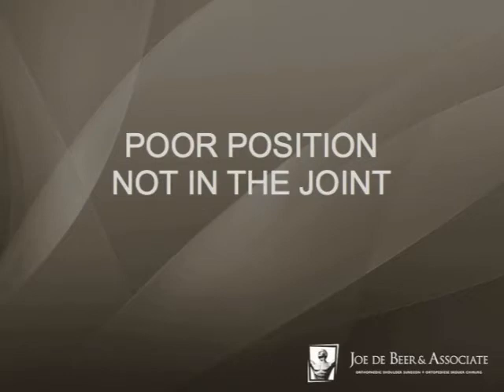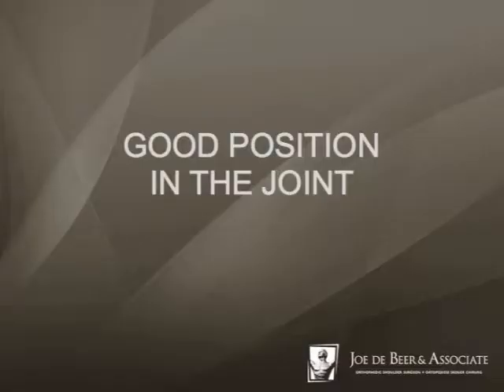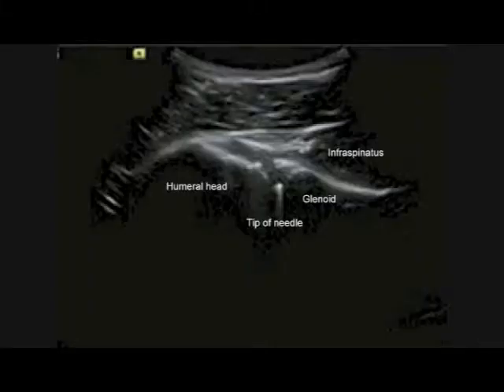To do glenohumeral joint injections with ultrasound control is very accurate. And the first one here is shown with the needle not in the joint because the fluid is leaking outside the joint. And this shows you the humeral head, the fluid outside, and the glenoid on the right side. But this was unsuccessful. When the needle is accurately inside the joint, and as one injects, you will find the fluid exiting the needle in the joint with no leakage. And again here you see the tip of the needle between the humeral head and the glenoid.